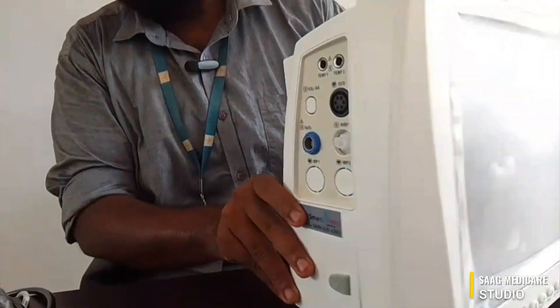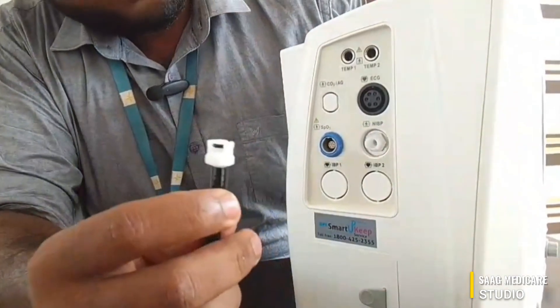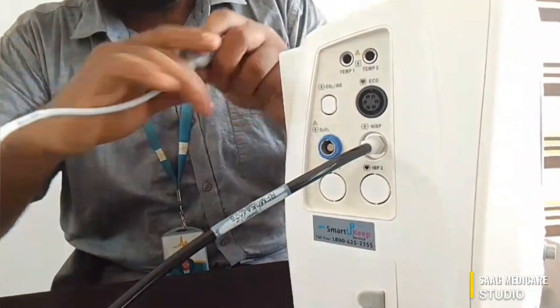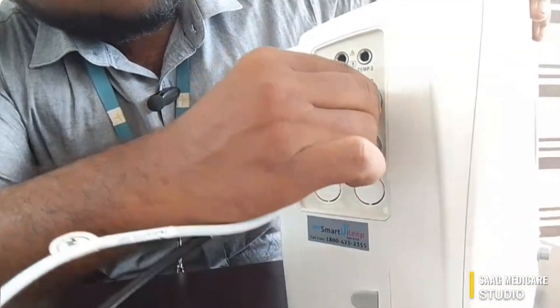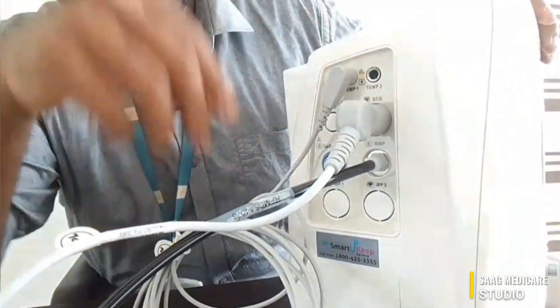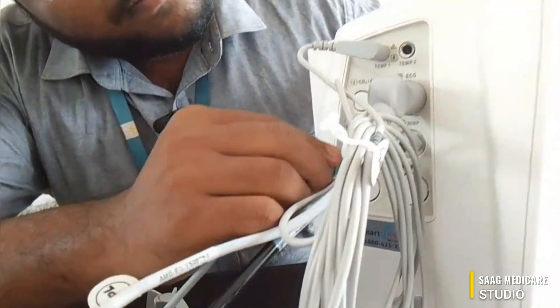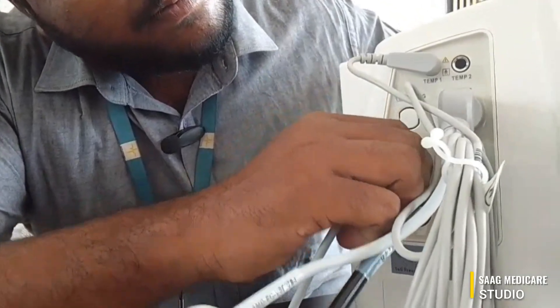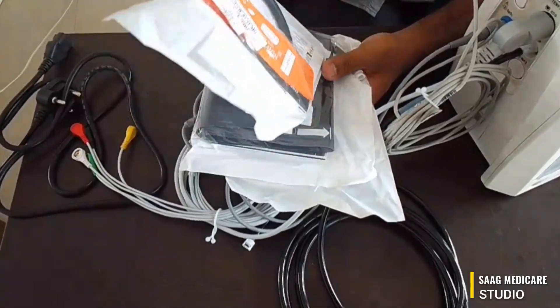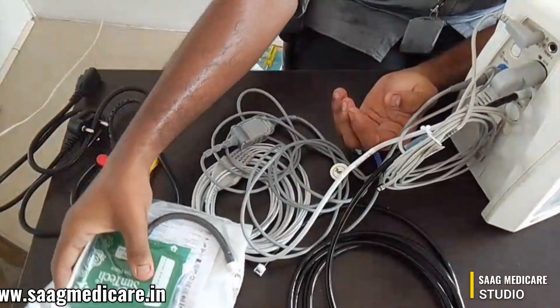Now we can make our connections. First, we can connect our NIBP — just connect it like this. Then we can connect our ECG, our temperature sensor, and finally our SPO2. For NIBP, they have included three types of cuffs: the first one is for infant, the second one is for adult, and the third is a child cuff — three types of cuffs are available.